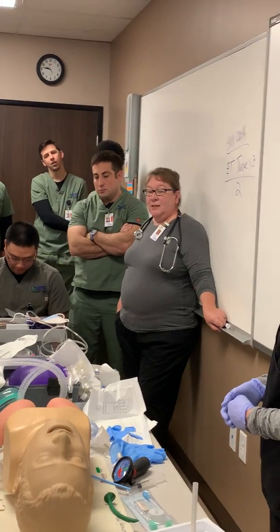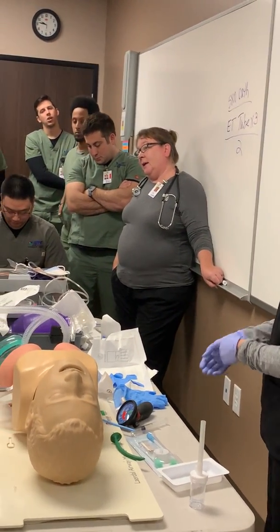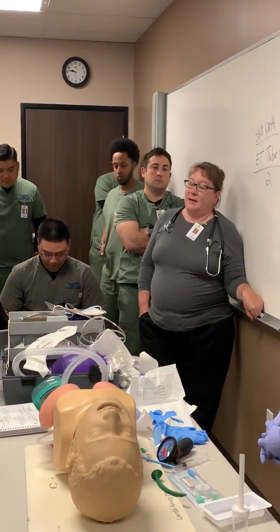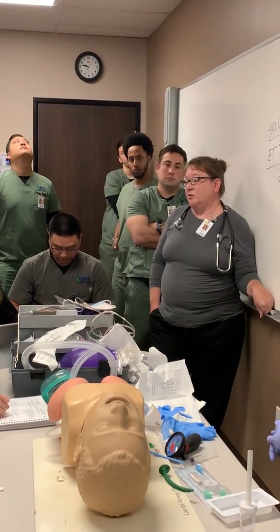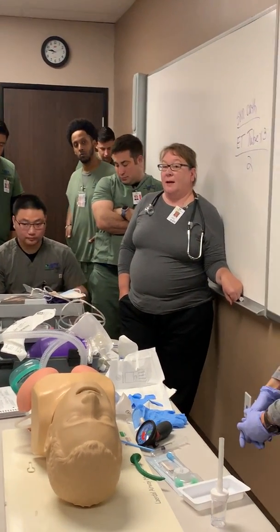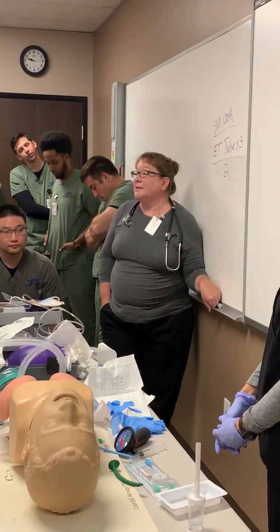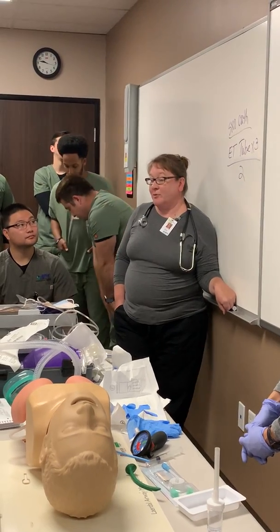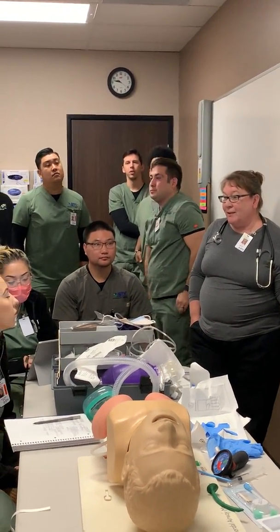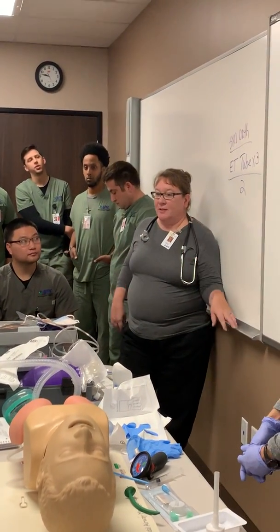That's how you know, because sometimes your questions will say you can't suction and you're using a 10 French catheter and you have an 8 size ET tube. Well, your catheter is too small, so you should switch to a 12. Other times the question might say you can't suction, you have a 12 and a size 8 tube, so you have the proper suction catheter size, but the vacuum's at minus 80. So what do you have to do then? Turn up the suction pressure. So those are the things you'll see about that.